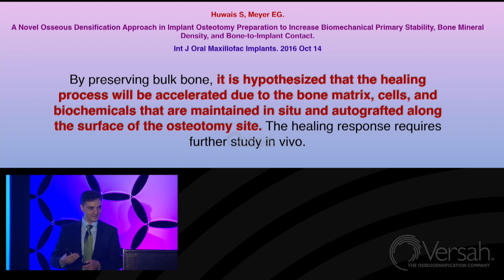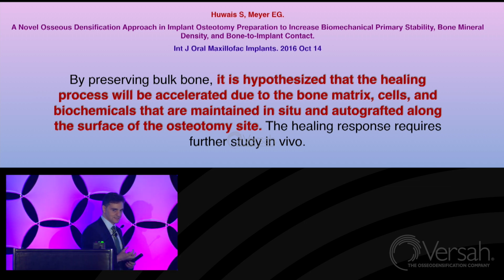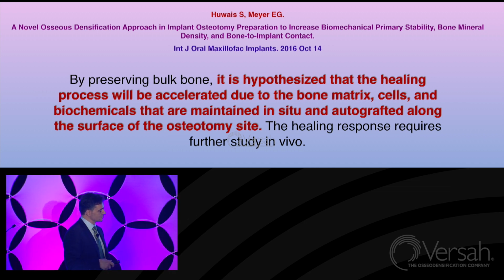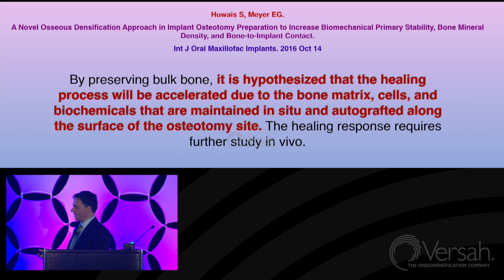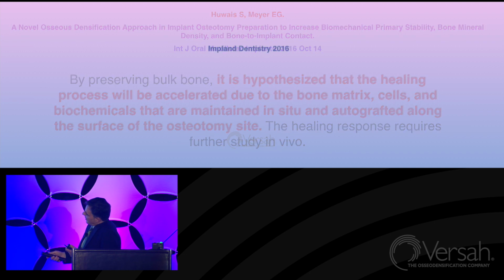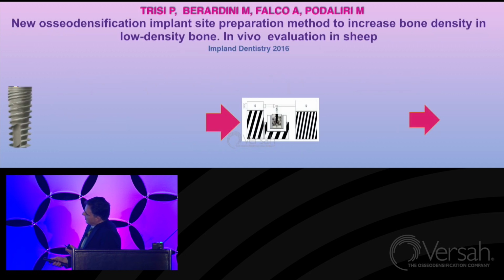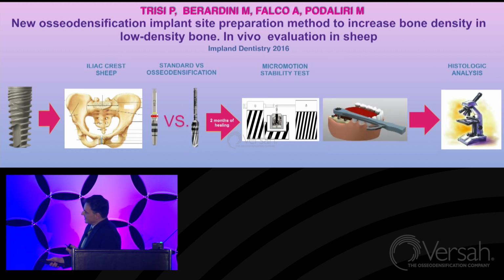We did the study, and our rationale was to prove that by densification of the bone with the implants, we not only have an increase in the primary stability, but also in the secondary stability. This was the focus of this study that was published last year in the Implant Dentistry journal. We were focusing on increasing density in low-density bone by measuring the reverse torque and micromovement after healing, which is secondary stability.